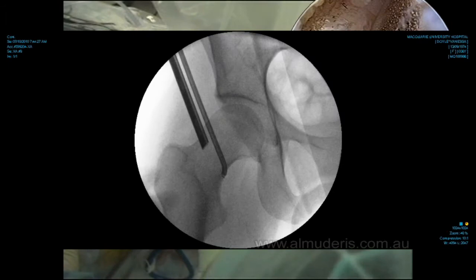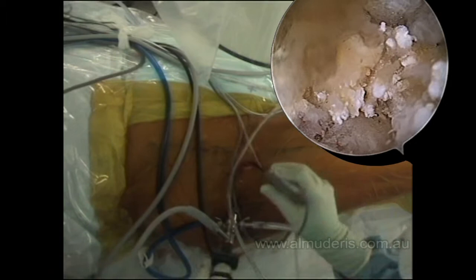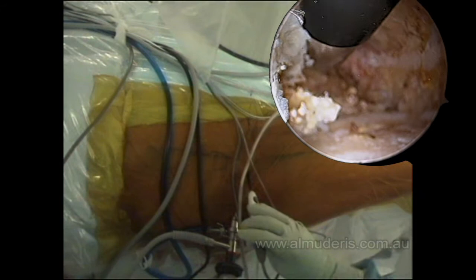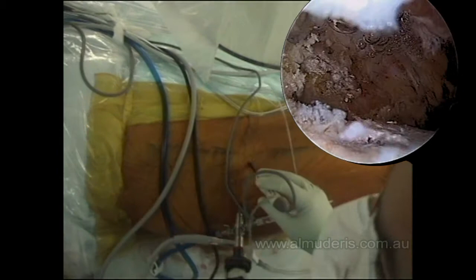It is an extremely tight space, but gradually the cavity will increase. I am looking at the inferior portion of the femoral neck. I am now increasing the space in the capsule by releasing the anterior capsule — by doing that the space significantly enlarges and the field is visualized much better. You can see the view is now panoramic and we can see most of the region around the femoral neck.